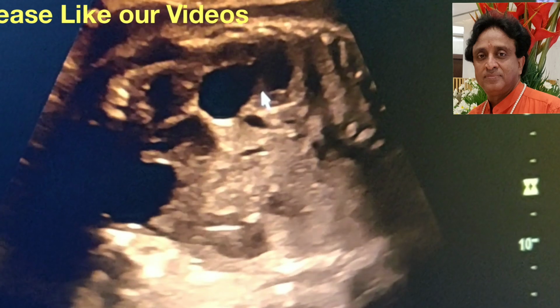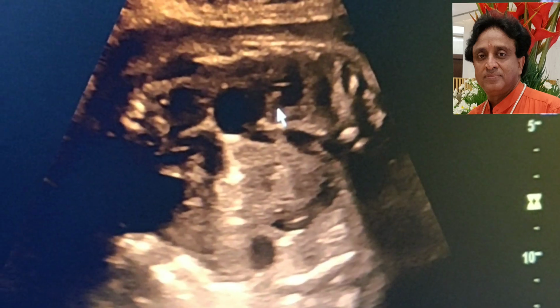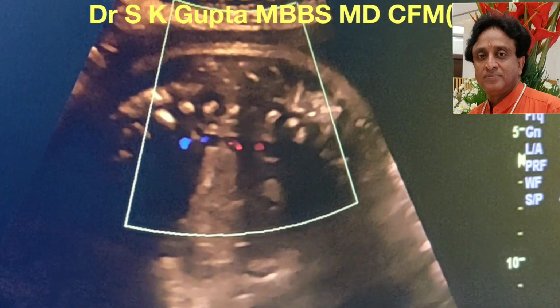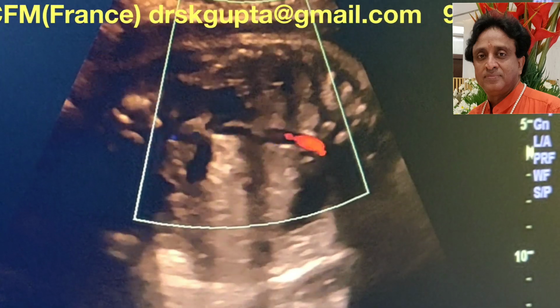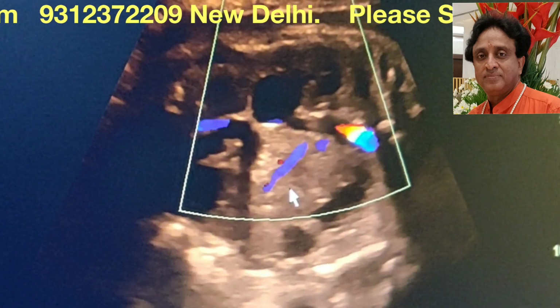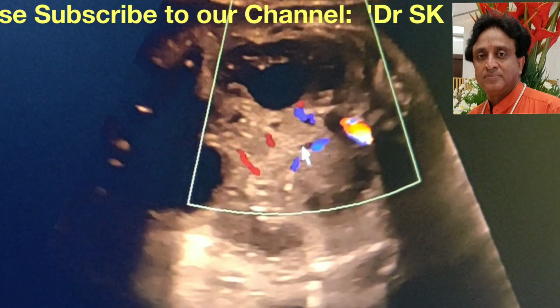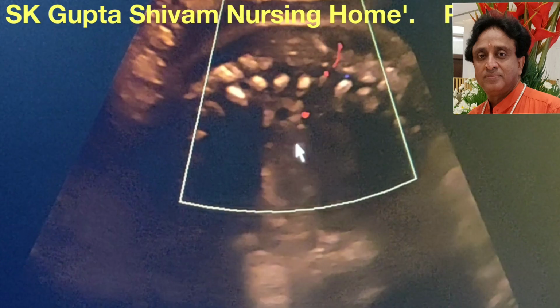This is the spine. On one side of the spine you see the kidney, and I try to put color, and you can see that the central vessel is the aorta, and on two sides are the two kidneys. This may be one kidney, not very well seen, slightly hypoechoic also. This is not the renal vessel. This is the iliac artery probably, and this is the kidney. I try to make a view.